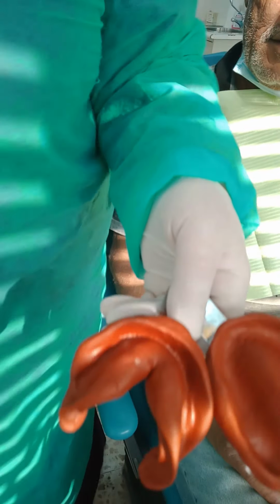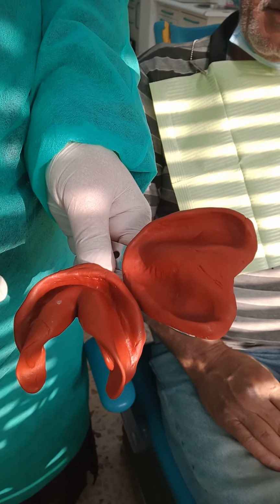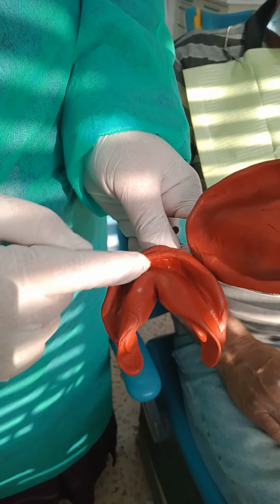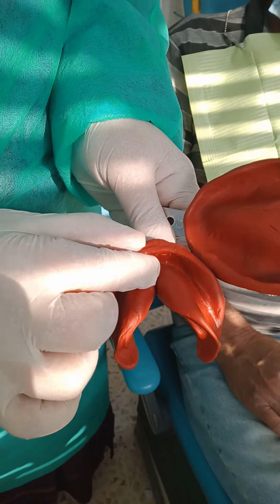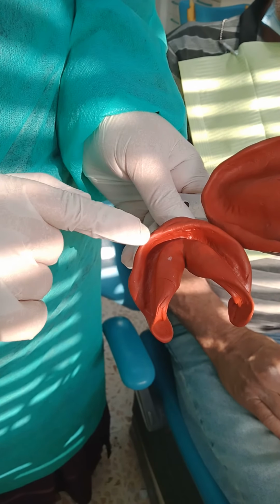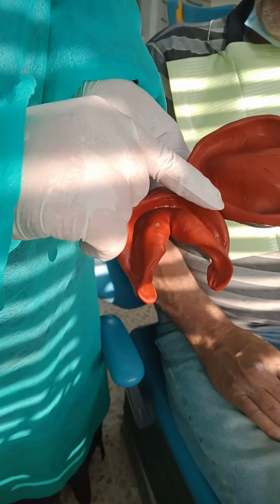I'm going to talk about the effect of knowing the anatomy on the evaluation of the impression. What you need to know is that the labial part of the ridge is usually thinner than the posterior, so that's why we place less material here. Once we take the impression, the labial sulcus is a bit deeper. The deepest point is in the premolar area, then it goes back to being shallow. So the premolar area is the deepest on the buccal.